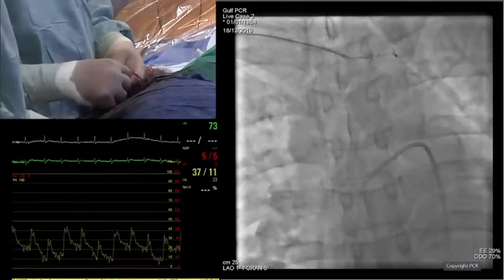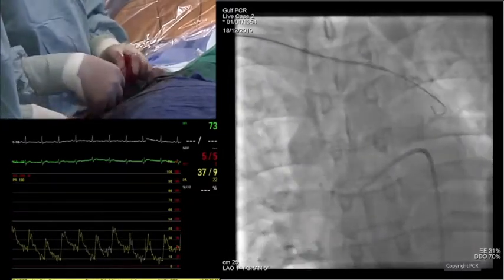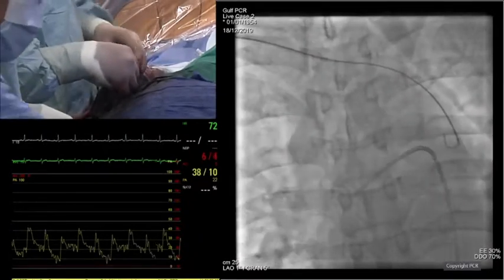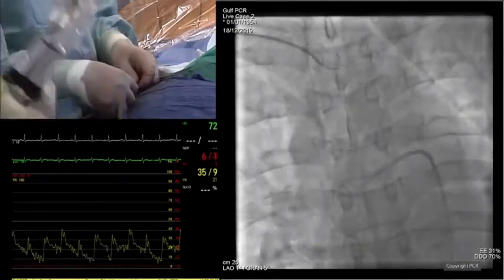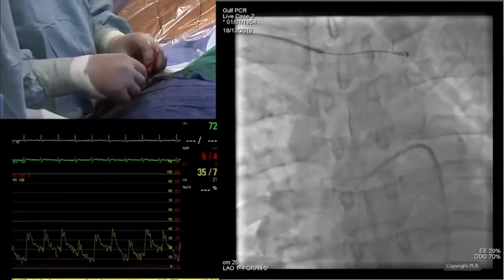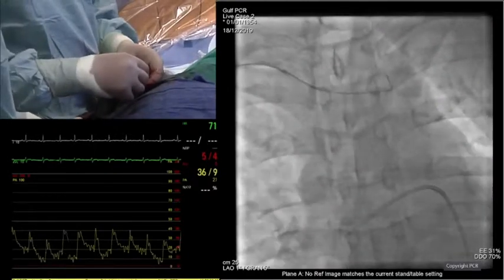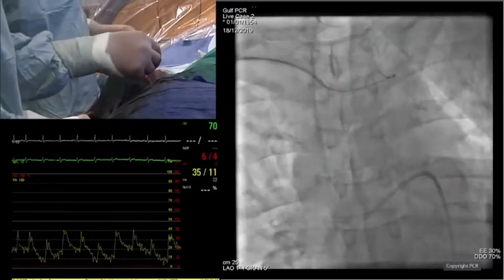It's true that without OCT, maybe we would be inclined to use a debulking device in order to facilitate. But what Mohammed Sobhi said, a 25% ejection fraction for rotablator, that could be a problem. In case of any complication, remember that in the clinical presentation of the patient, there is akinesia of the inferior wall. So if you have akinesia of the inferior wall, 25% ejection fraction, and you get no reflow phenomenon using rotablation in the LAD, this could really be a major problem concerning hemodynamics.